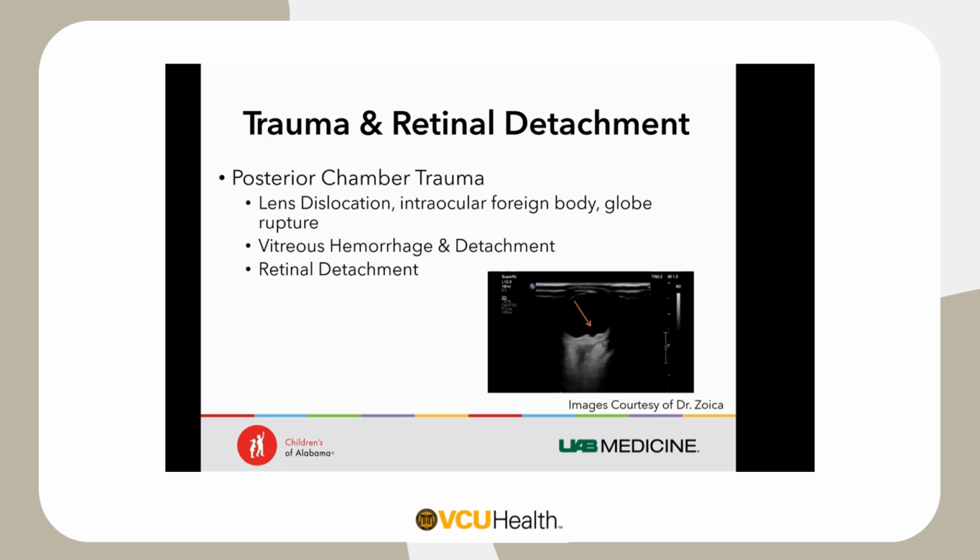And this was done by providers that had regular training in ocular ultrasound, and they showed really nice sensitivity and specificity, especially for the intraocular foreign body and globe rupture, with low risk of bias, that was almost at 100% for both of them. So this was a great use of ocular ultrasound to get treatment as fast for these patients as possible.